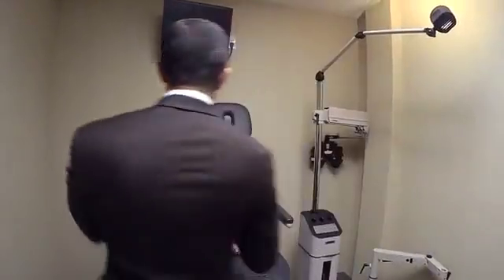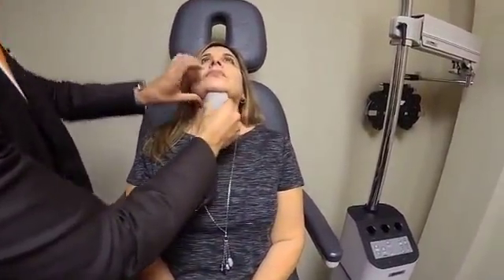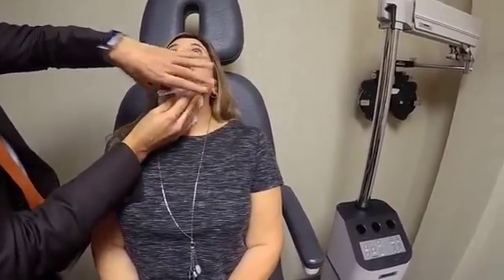And that's what we're going to be doing today. Gina has had her neck cleaned with an alcohol swab, and we're going to use a marking grid to point out exactly how much Kybella needs to be treated. So let's get started. This marking grid we place on basically shows us how much Kybella needs to be injected into the area. This is the funny part where I'm strangling my patient, just holding it down. We have a wet gauze. You'll see there's going to be some dots that are transferred over onto her chin, and that'll guide us exactly how much needs to be treated. Okay, let's just make sure we have that on there. Okay, great. And we're going to peel that off.